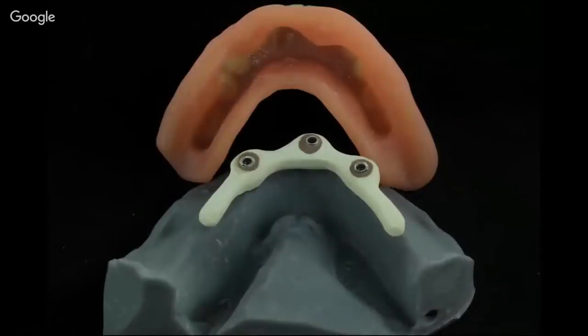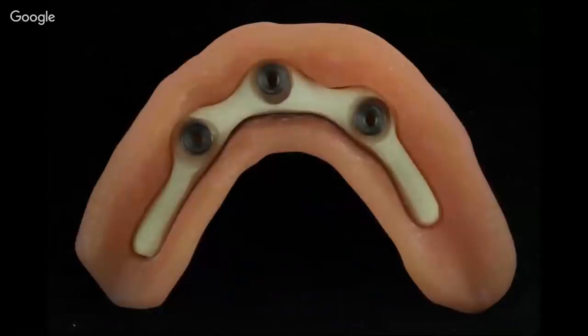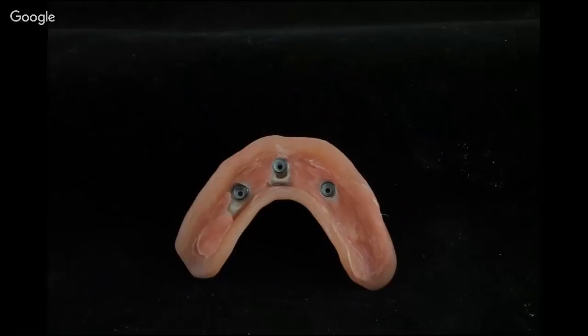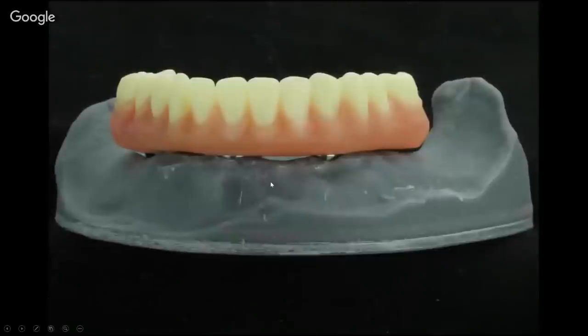So again, let's pretend this is your patient, and now let's pick this bar up in the mouth. Put some long screws into those access holes and make sure that you've got access to them through the top of the denture. And now just use chairside acrylic and do a pickup. You see how now the pickup has been done and that bar is encased in acrylic? You'll probably have a couple of little spots that you'll need to go back and salt and pepper in to make this smooth on the underside.